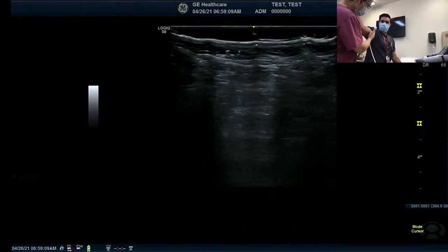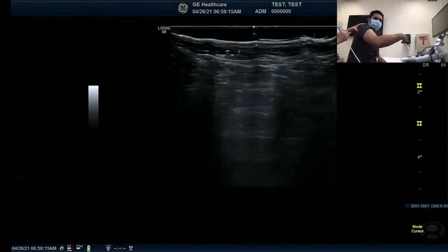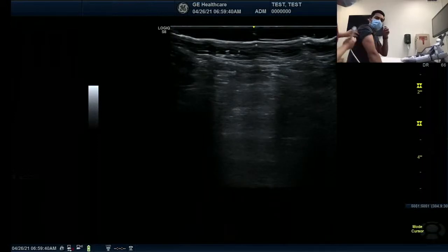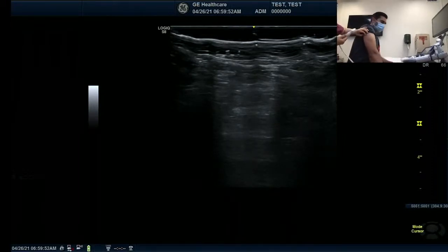The radial nerve starts from here and goes to the posterior part. You can see this area is going to be the triangular interval. The proximal part is the teres major, and then the humerus, and the other one is the long head of the triceps, which makes the triangle. When the radial nerve passes this triangular interval, it goes to the posterior part of the arm. Then the radial nerve comes between the long head and medial head along with the deep brachial artery.